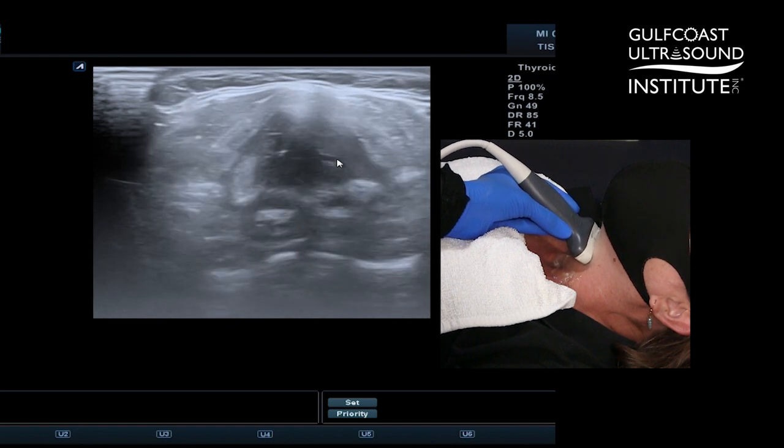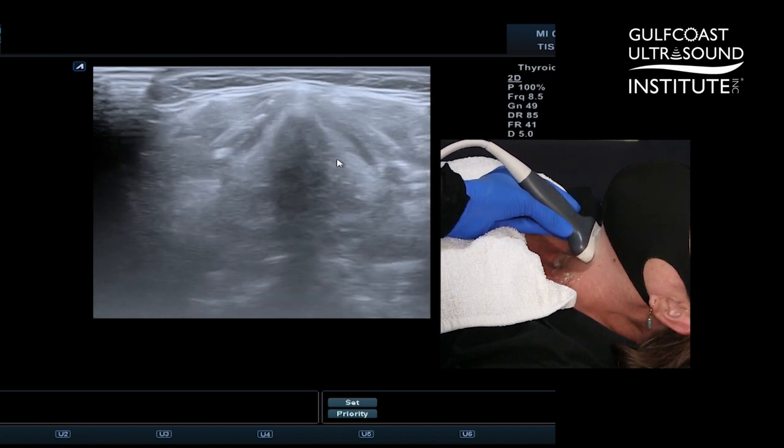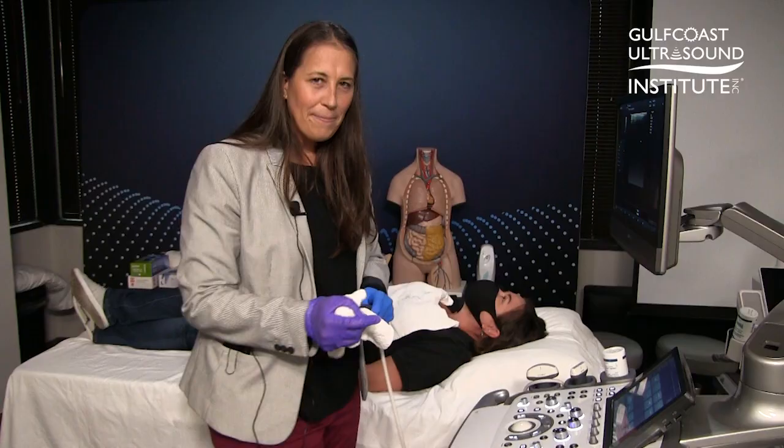So this is vocal fold ultrasound and this is your hot tip for the day. Now you try.